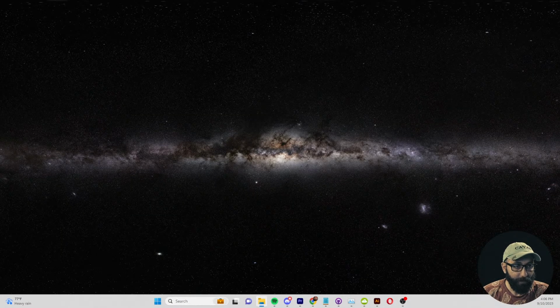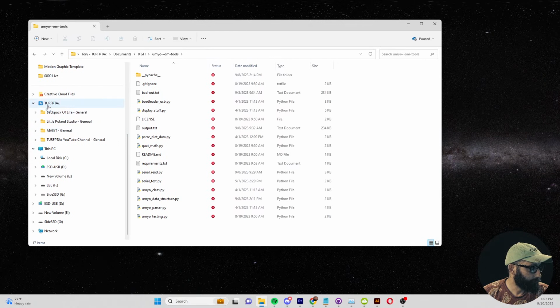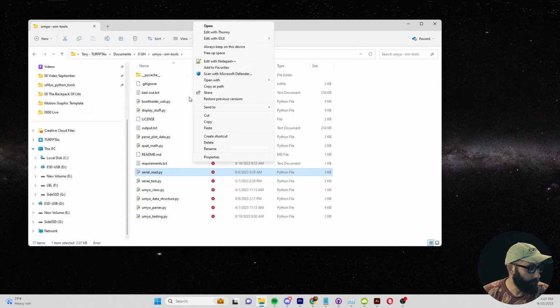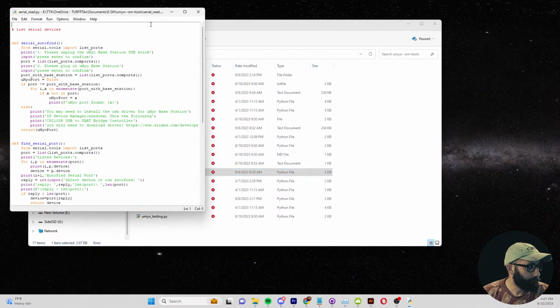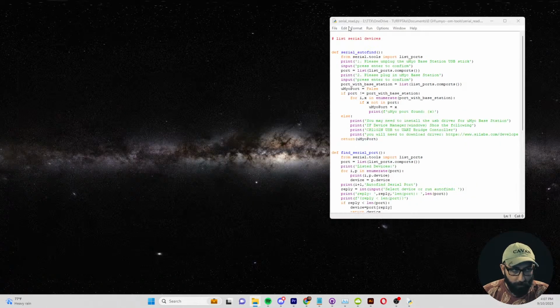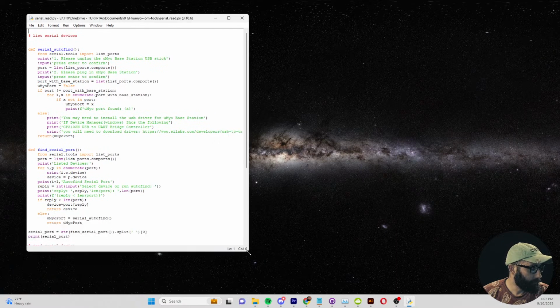So, two folders I'm going to open up. Going to open up the code that I worked on yesterday, and that basically just read the serial, and I created my own uMyo tools here, so you can see all the stuff I'm working on. But let's open up serial read. This is the Python program that I made, and we're going to open it up. Serial read. So let's just double check that this works.